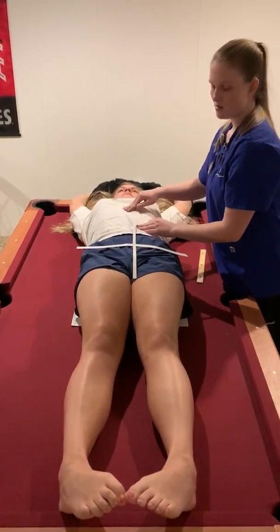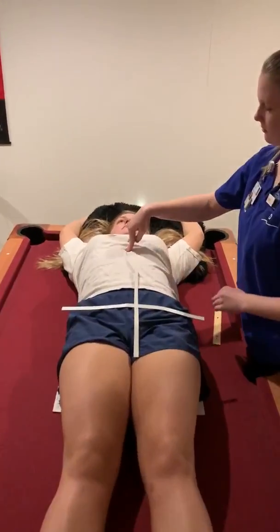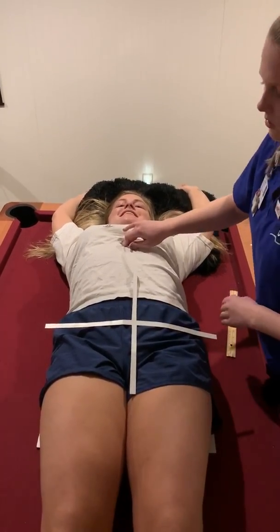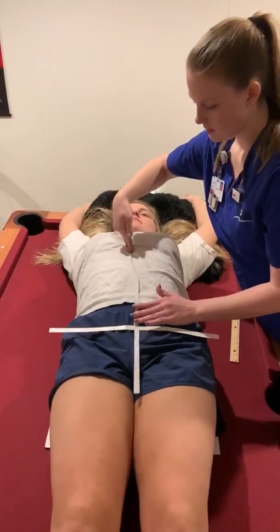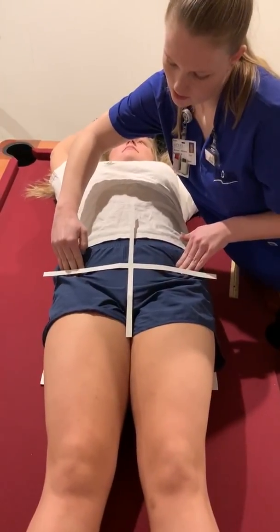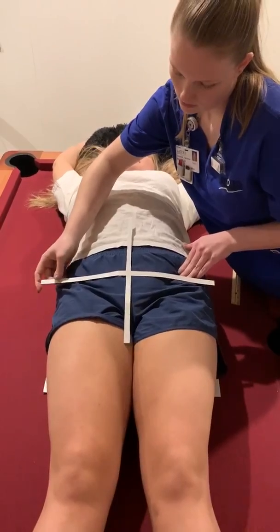One way to do that is by palpating for the xiphoid process, which is right here, or you can double check by feeling for both ASIS and making sure it's in between them, midway, right there.